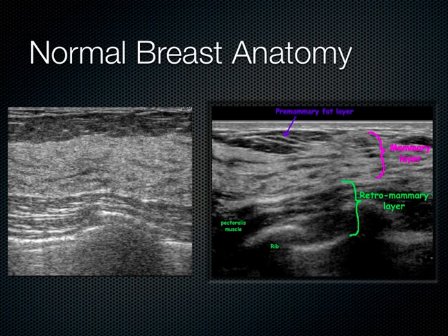Now, the normal breast anatomy is very simple, and like most glandular tissue, it has a very typical layering. So we can see really three main layers here. This is layer number one, the subcutaneous layer. This is just subcutaneous fat here. And then, like all glandular tissue that we've seen on ultrasound so far, the thyroid, the testicles, things like that, it has this sort of appearance, relatively isoechoic here, with the different lobules of breast tissue. So that's called the glandular layer.